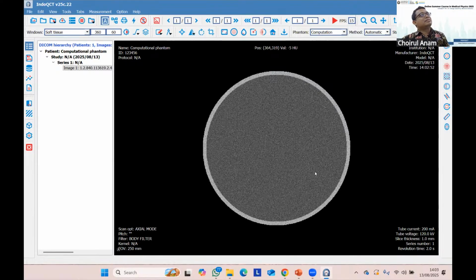It appears that we will need to upload our system images, after which the software will generate and display image quality parameters, such as MTF, to facilitate the evaluation of our system performance. But here we can change or play with the image and change its parameters manually. Please explain this.